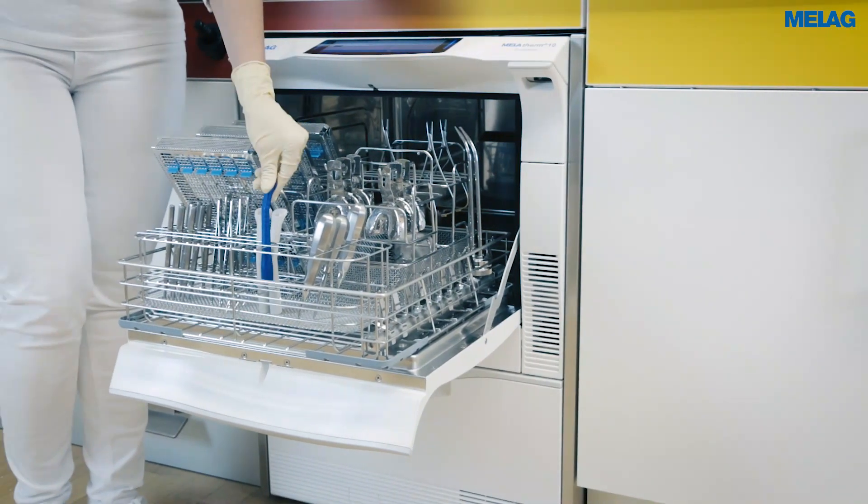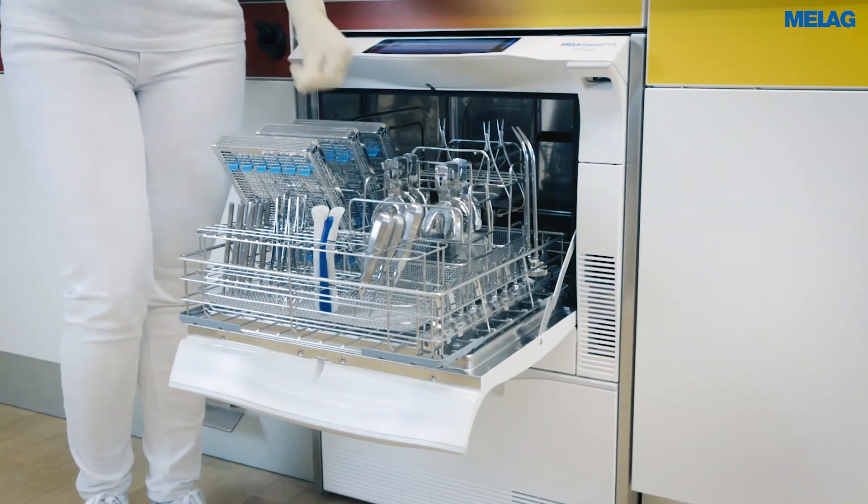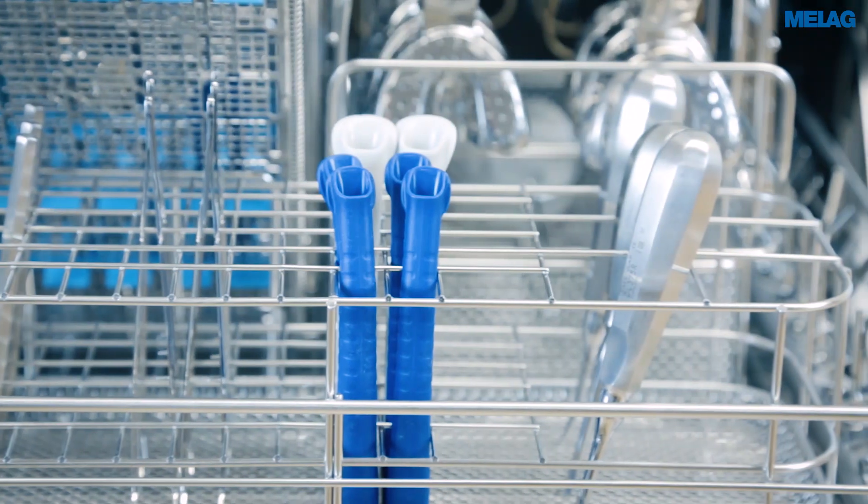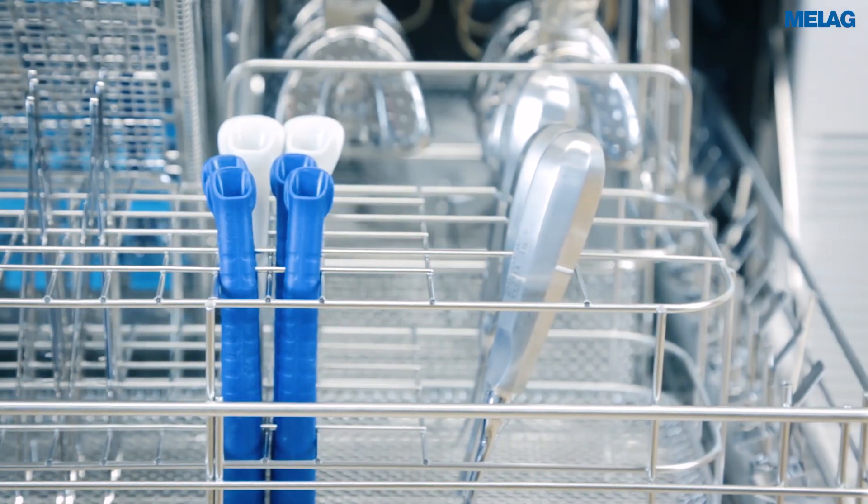Only the Melotherm 10 Evolution enables the decontamination of universal suction cannulas with a diameter of 11 to 16 mm, standing in the instrument basket.